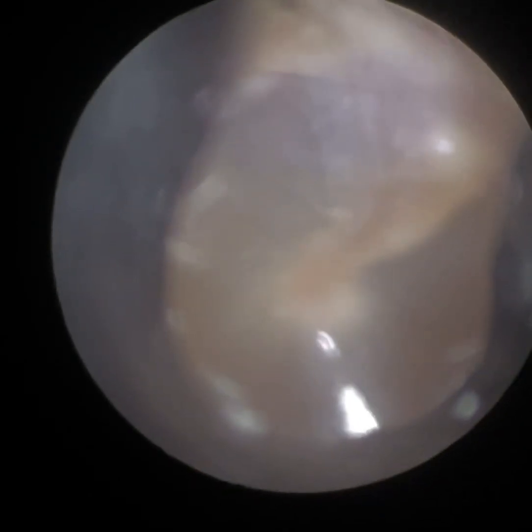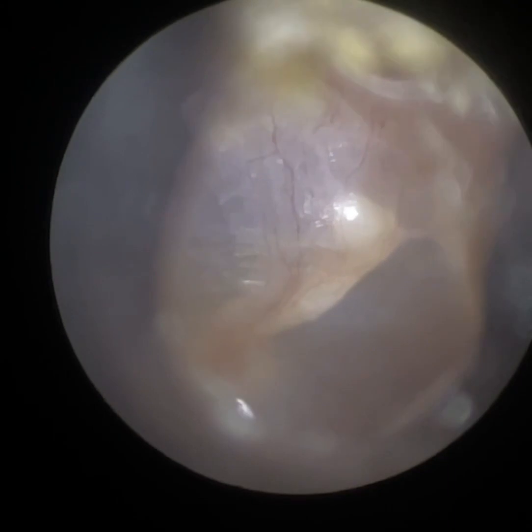I think I use an earhook eventually just to remove this — I think it's in the left side. You can see here I'm just mobilizing this board of wax. They've got very dry ears, so they do use some olive oil spray. I recommend the Clearwax olive oil spray — it's something that we sell on our Clearwax website, both to the public under our online shop. If you visit www.clearwax.co.uk and shop, you can see our olive oil medical grade ear spray. We also sell it to professionals via our trade shop.